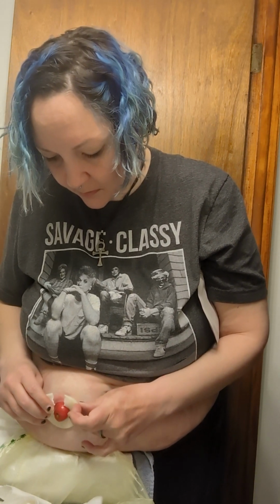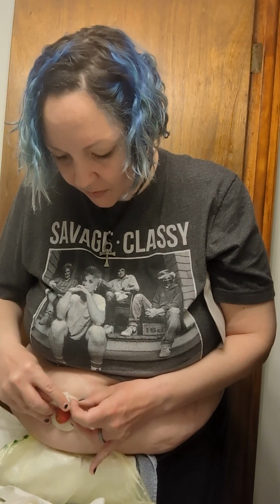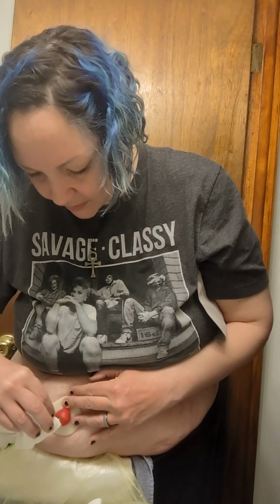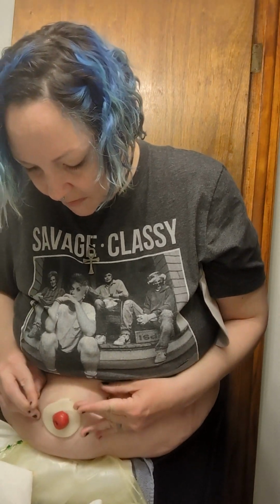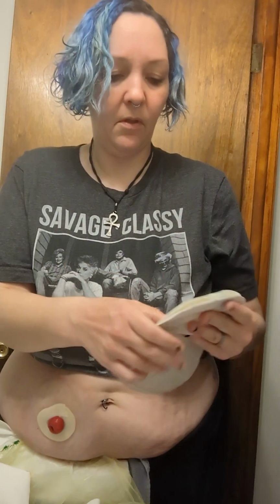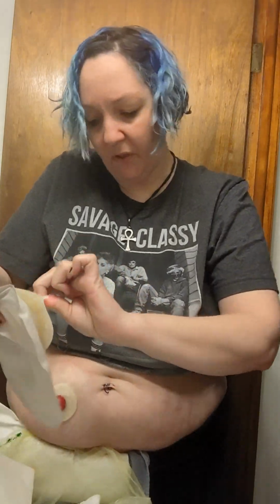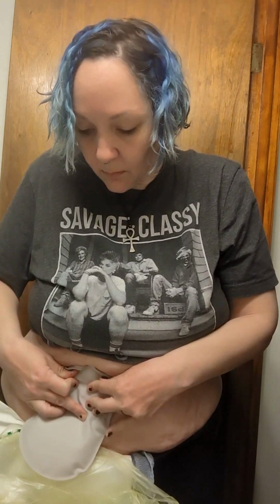Now this is a nice barrier to protect your skin, because it's not just for an ileostomy, but also a colostomy or urostomy, which is for urine. I didn't even know about them until I became an ostomate. A barrier ring is very beneficial to all. All right, let's go. Oh, she's about to go. Don't you dare do it. That's it. And then obviously cleanup time, right?